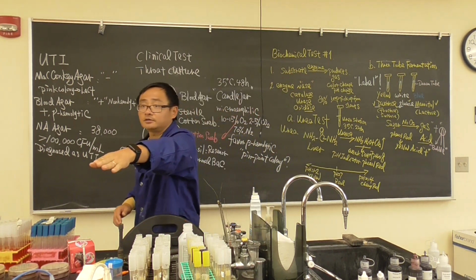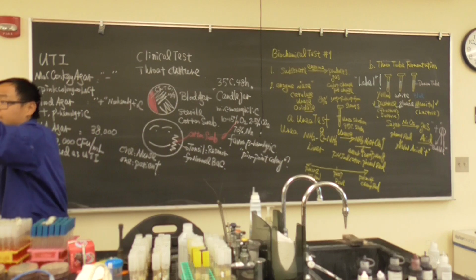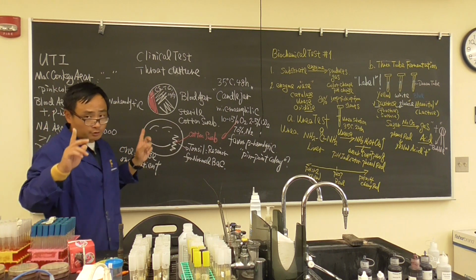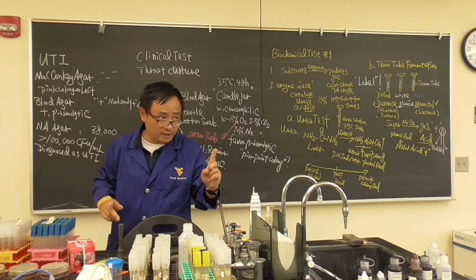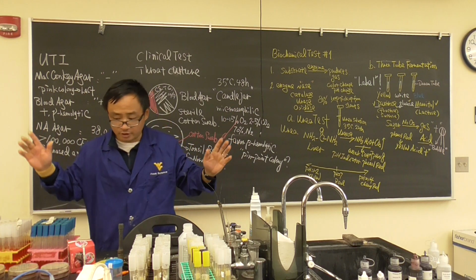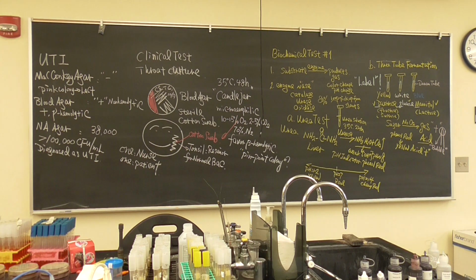Here, E. coli, Bacillus, Lactobacillus, and Citrobacter. Okay? Two of you are only responsible for 1 bacterium, and we'll share the results on Thursday. So that's the work we're going to do.